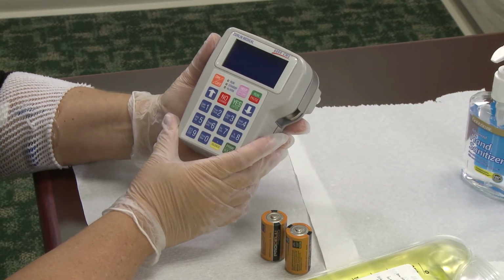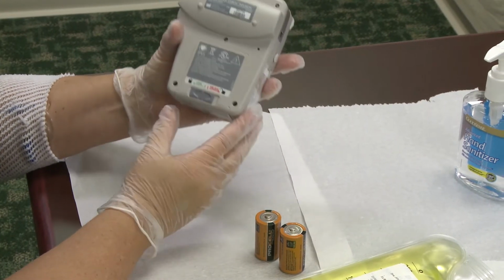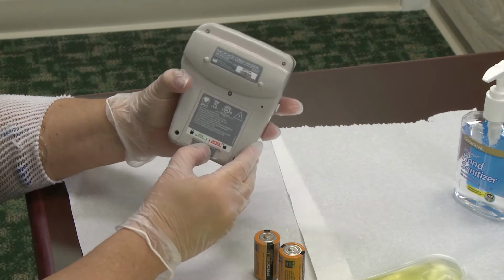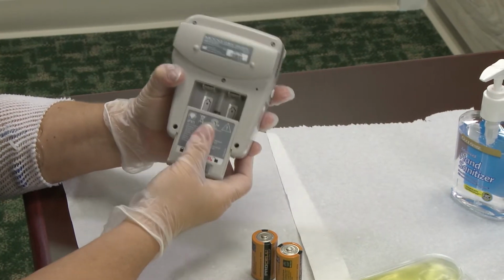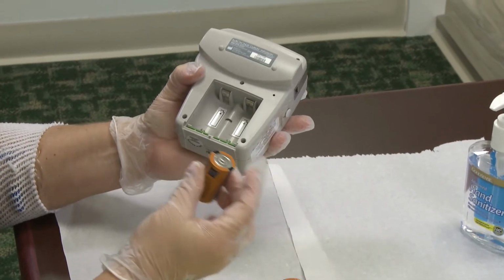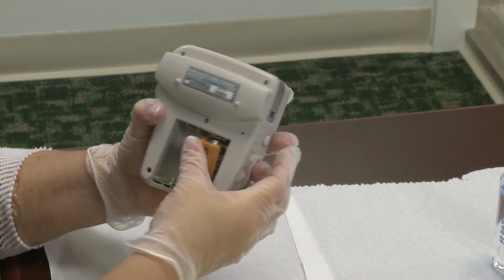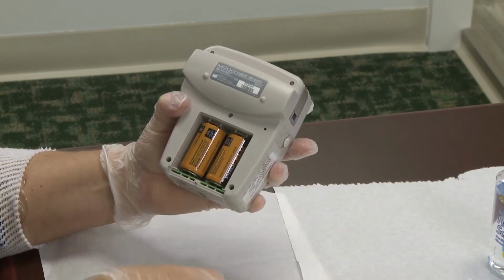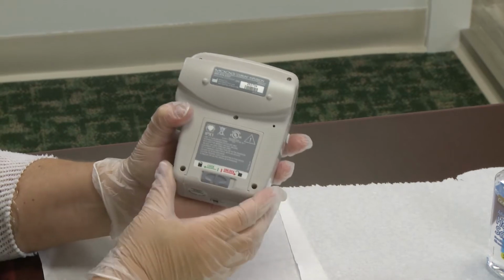And the first thing I'm going to show you is how to put the batteries in this pump. The batteries go through the back. There's a door here that we're going to unlock. You see lock and unlock, and I pushed this towards unlock, and I pull down. It takes 2 C batteries that we send you. They both go in the same direction, which is a little unusual. And the door goes back on. And then you lock it so it won't come off.